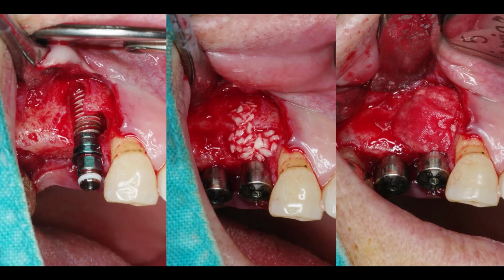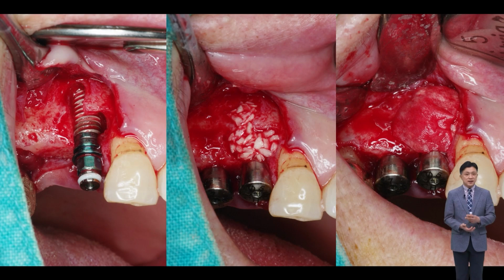In this case, I placed it deep, 3 millimeters from the proximal bone crest of the adjacent tooth. The implant is placed, bone graft is done, the healing abutment is connected, a collagen membrane is used to cover it, and surgery was completed.